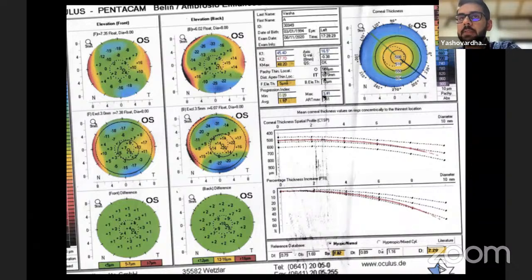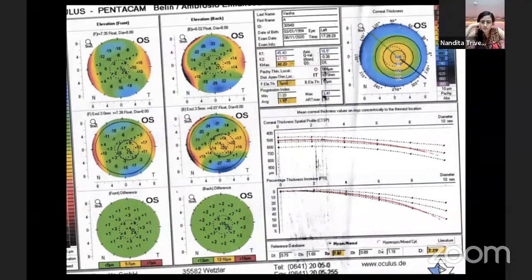And coming to the back aspect, the first image shows us the raw data, and then when we are seeing it, it is 14 and 20. So that is falling in the yellow category. That is definitely a red flag here. And when we see the difference, it comes out to be +10 and +9. So for the posterior elevation, it is all right.